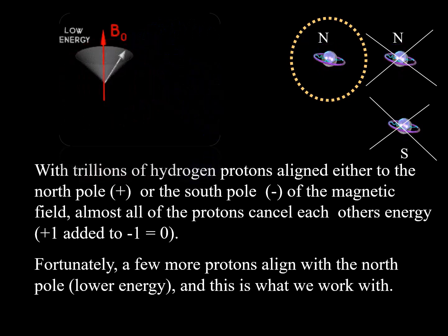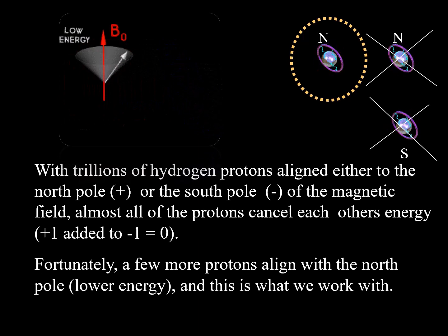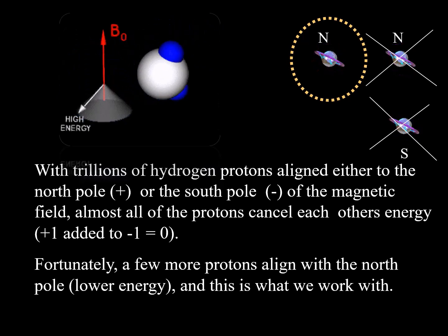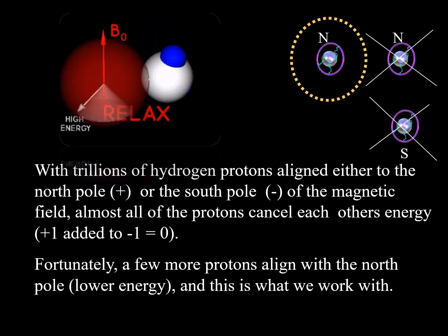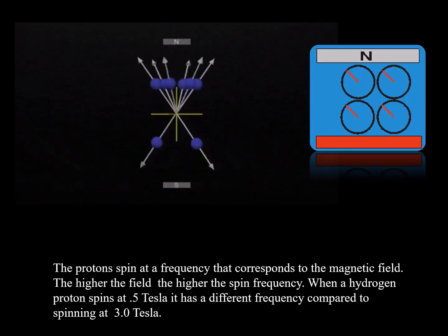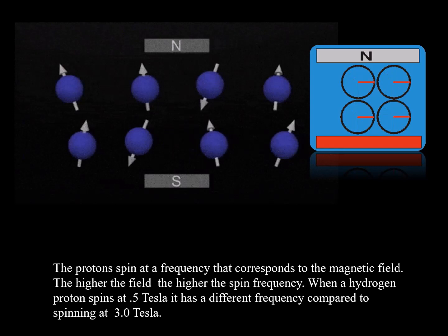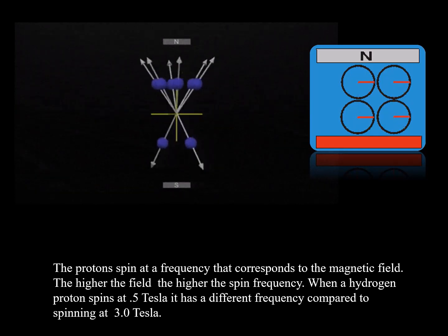The higher the frequency, the higher the signal strength, so therefore there's less time needed to gather the information needed to create images. The MR magnet is always on, so when the patient leaves the magnet, the protons return to their original state. In their original state, the protons wobble very similar to the Earth rotating on its axis. This is known as precession both for the Earth and for the protons.